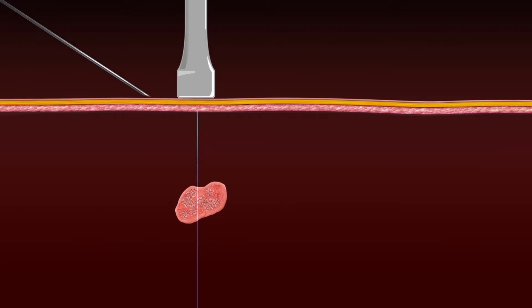Pay close attention to where the needle appears on the screen as it crosses the field. If you see the needle appear above the target, you need to pull back and reposition the needle with a steeper angle. Or if the needle is coming across the field below the target, pull back and adjust to a flatter angle until you see the needle crossing the field inside the target.